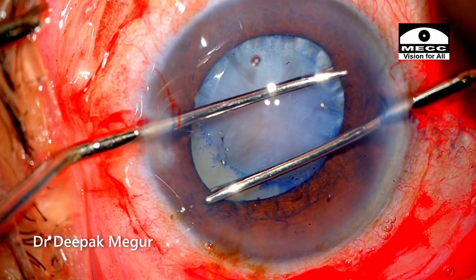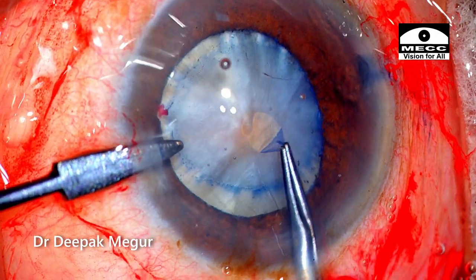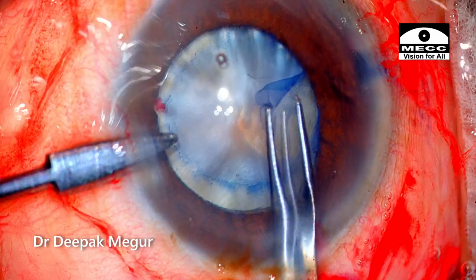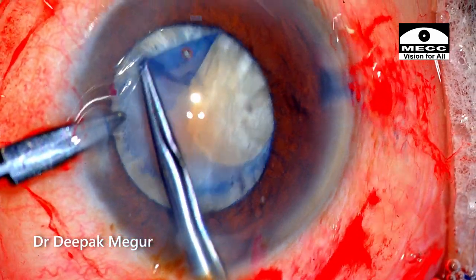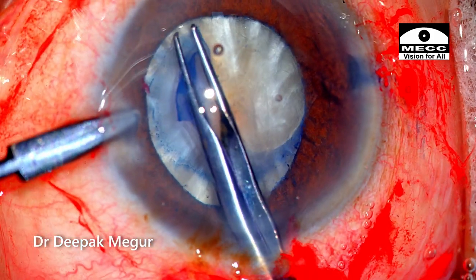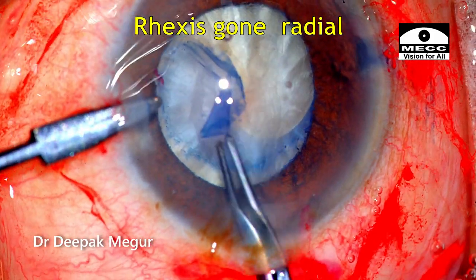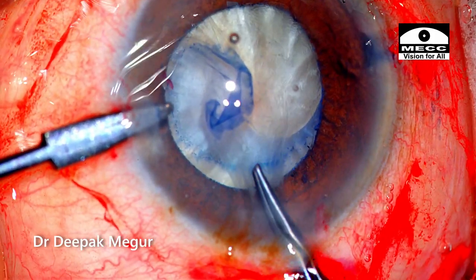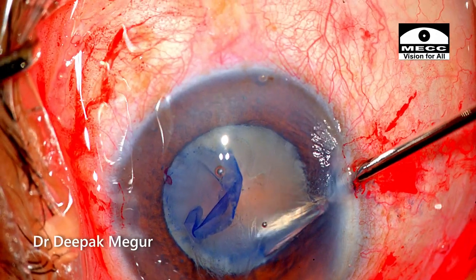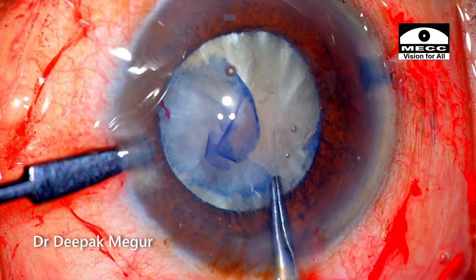During all this planning, the lens being intumescent has escaped my attention for a second. I begin my rhexis and it's the usual size rhexis instead of a smaller one which actually I had originally planned. And as I was realizing this, I could see that the rhexis has extended already and I could not salvage it. So, I make a nick from the other side and then extend it to complete some sort of a rhexis.